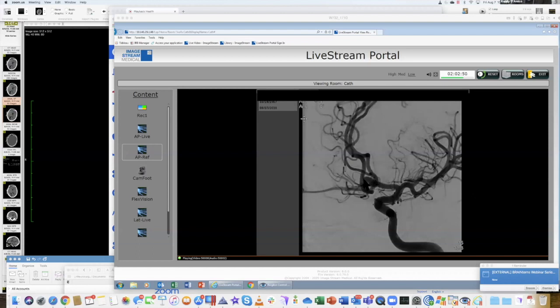So in this view, we can see the distal end of the aneurysm. However, the neck or origin, because of the angle and shape of the aneurysm, you could not tell where the origin was because it's overlapping. And we need to be very accurate at the time of putting the coils. Otherwise, we're at risk of causing a stroke if the coils are coming down into the normal artery. This is an anterior communicating artery that connects the left anterior cerebral artery with the right anterior cerebral artery. This is the left internal carotid artery.